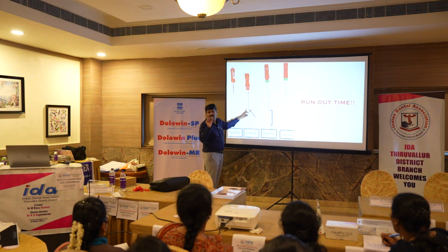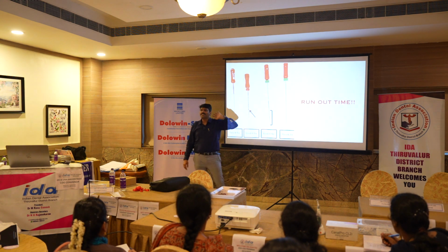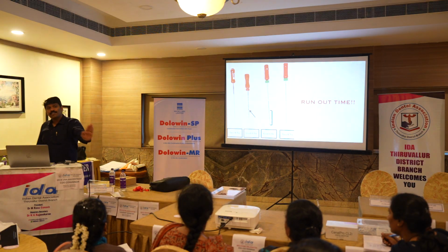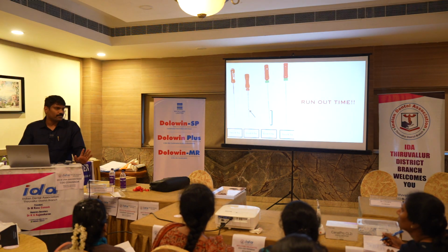You know it is going to fracture, so discard. You can even see elongation. Remove it, throw the file. You always have to inspect the K files. Nowadays, we see more K files breaking than rotary files. Be careful. I don't know why, but be very careful.